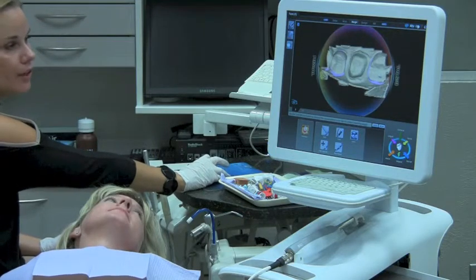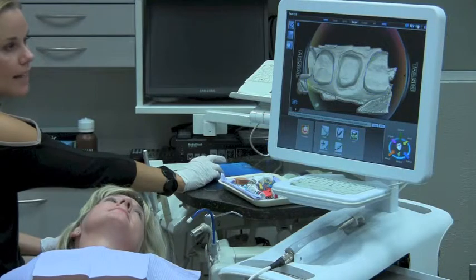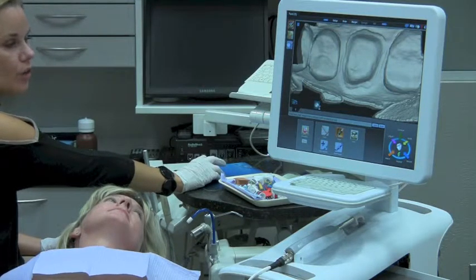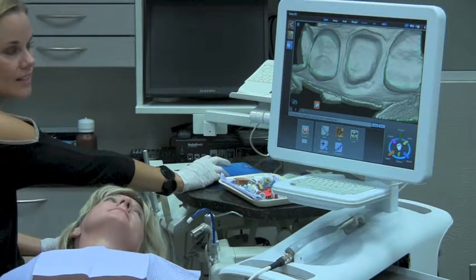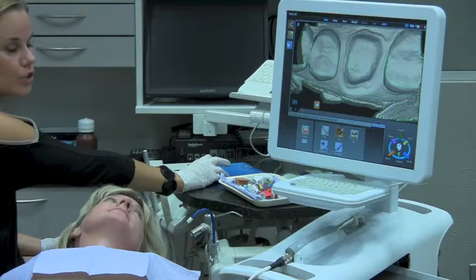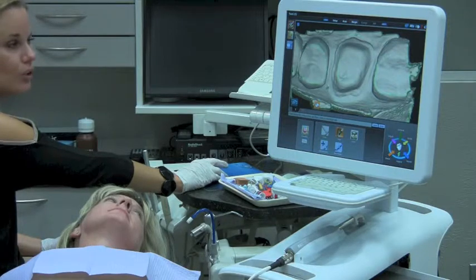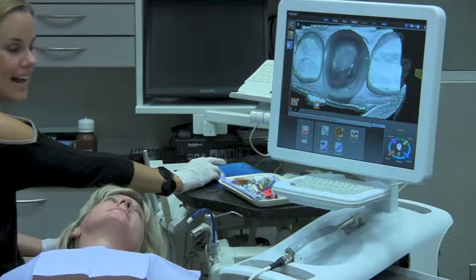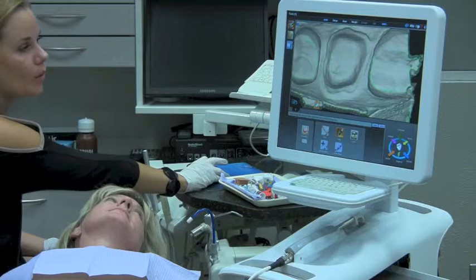When we go to the margin tab, we have to verify our orientation, which is just the position of the model. I'm ready to now mark my margin and I'm going to utilize the trace feature. By activating the show feature, it's going to show me where my margin is very supragingival, and in this area where the margin is a little more equigingival, I can see the margin very easily. I also have another tool called ICE that I can use to verify the margin — being able to see the actual raw data that the camera captured. ICE view stands for 'I see everything.'